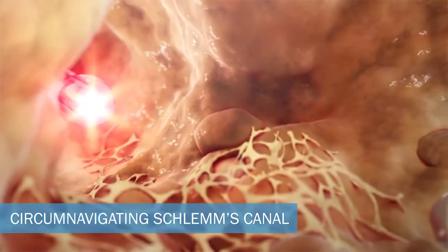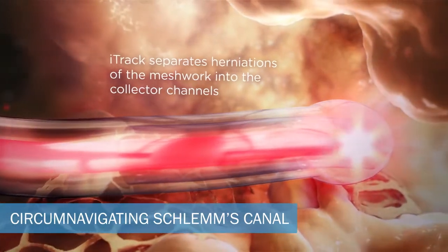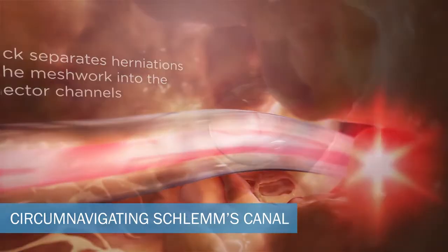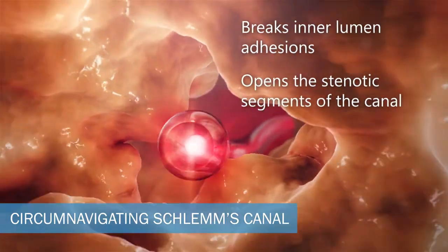During canal intubation, the iTrack separates the herniations of the meshwork into the collector channels. It also breaks inner wall adhesions and opens the stenotic segments of the canal.